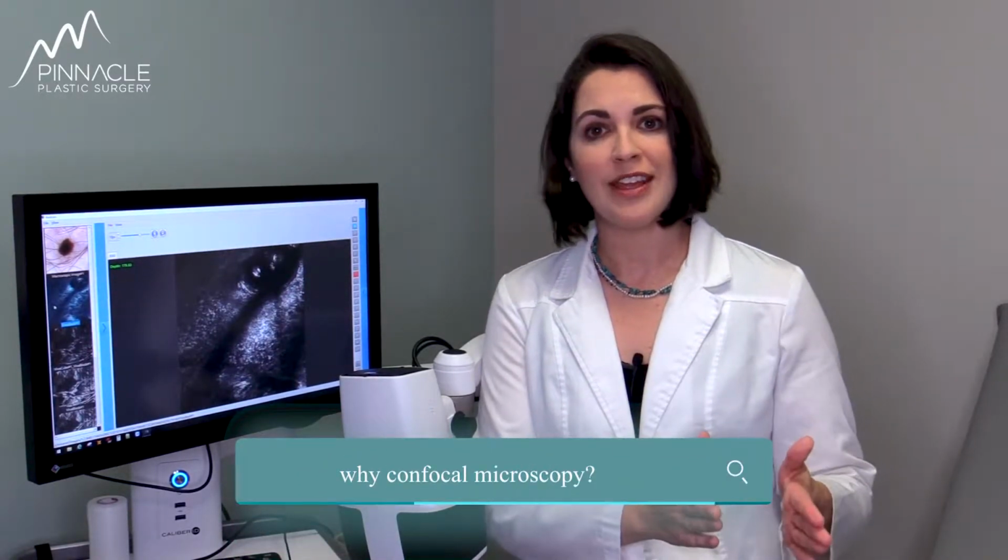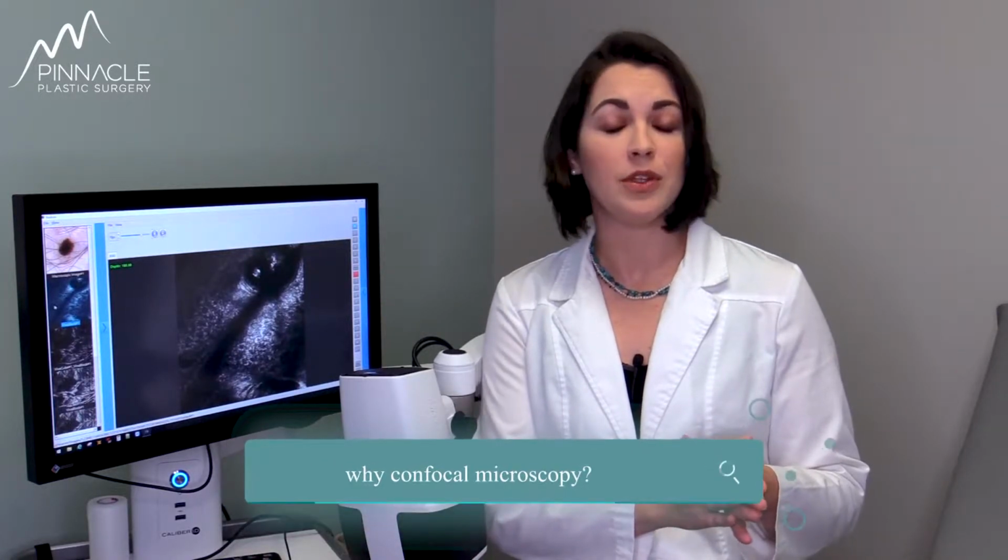Confocal technology is really meant to categorize a lesion into concerning and maybe needs an actual biopsy or needs to be completely removed. It has some features of both, and you can either watch it or biopsy it, or this is completely benign and you should leave it alone and just monitor it clinically or with additional confocal images in the future. So it really allows us to categorize a lesion into one of those 3 spots and then decide what to do about it.